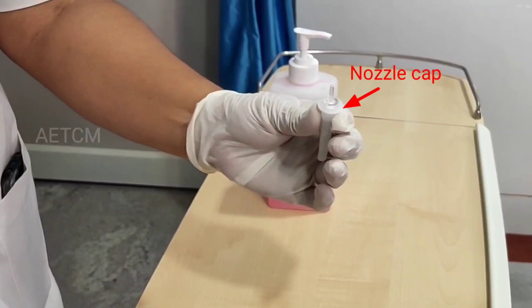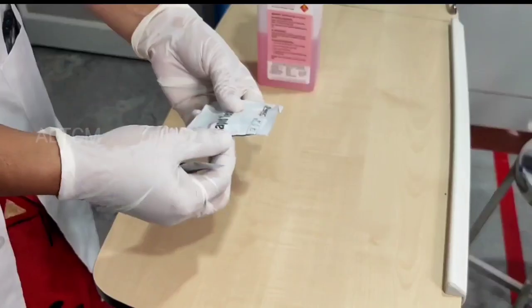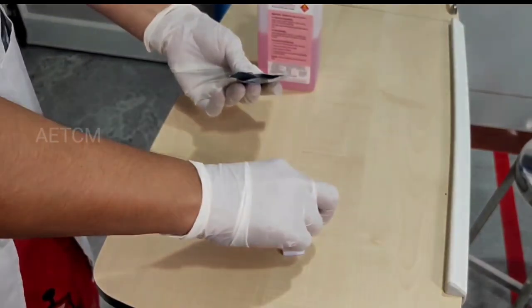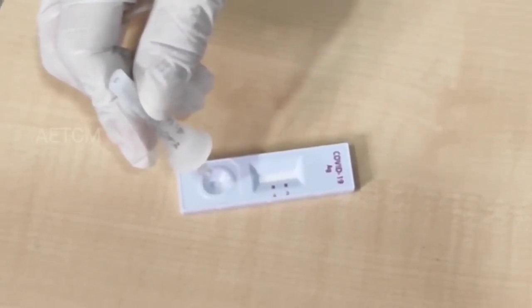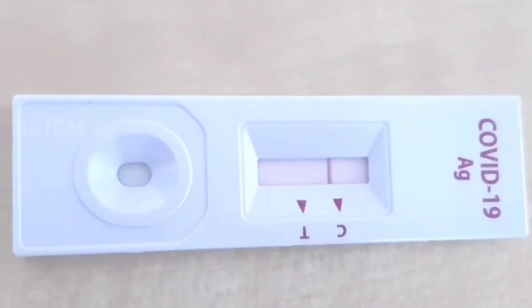Press the nozzle cap tightly onto the tube. Open the test device. Apply three drops of extracted specimen to the specimen well of the test device. Read the test result in 15 to 30 minutes.